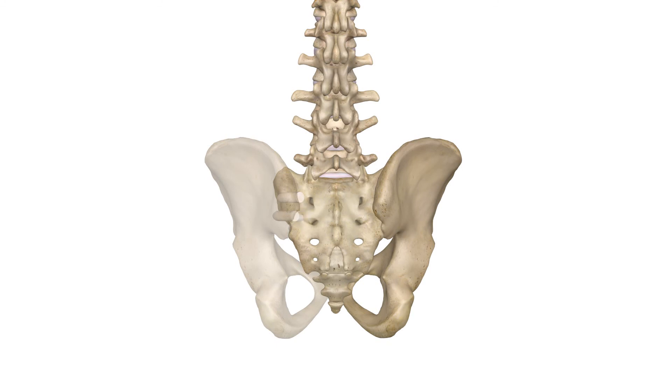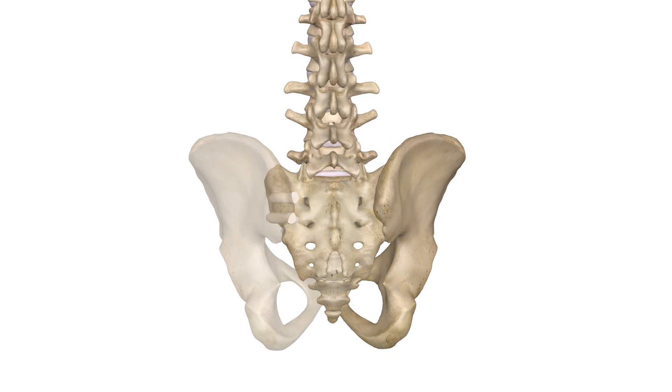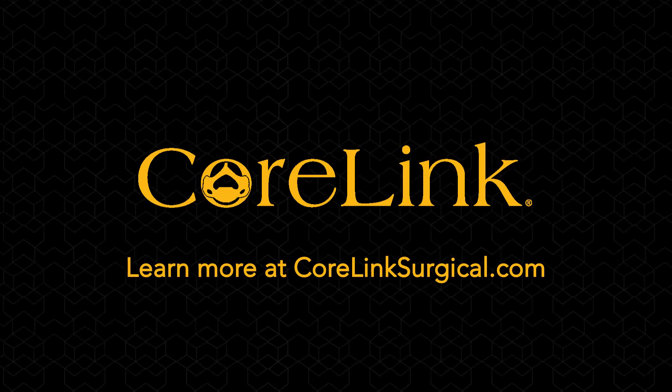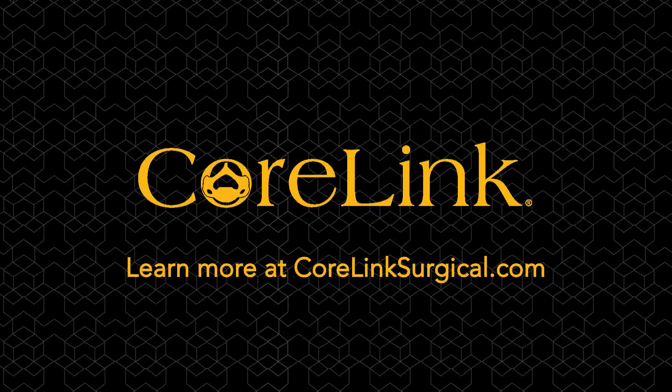Repeat these steps for the second allograft implant. To learn more, go to corelinksurgical.com.